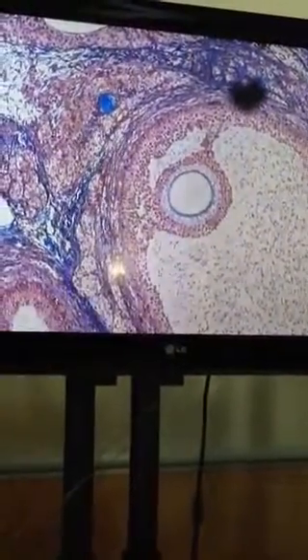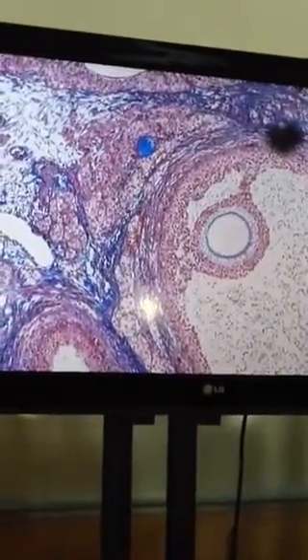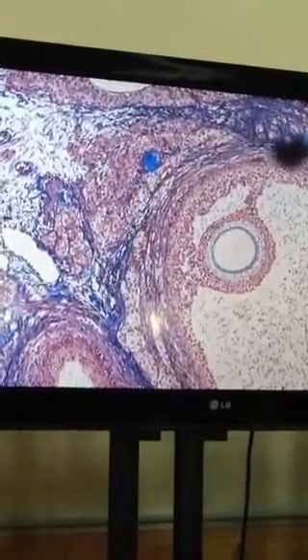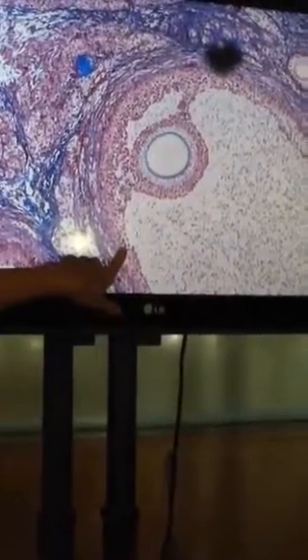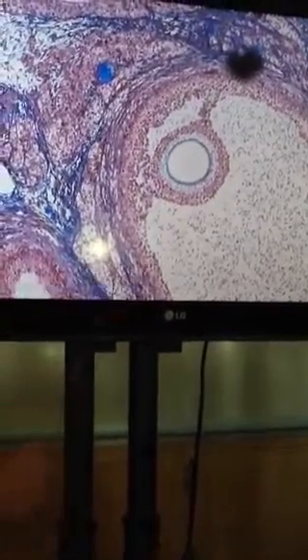Now, on the objective sheet I gave you, your review sheet for lab, I'm sure it was confusing because I put in a comma where I meant to put parentheses. So let me clarify this for you. These cells out here are all called follicle cells, but there are two kinds.